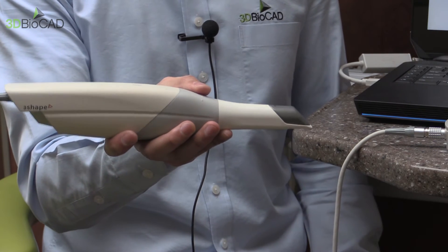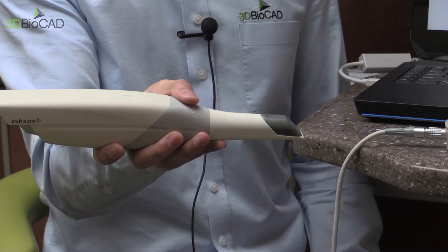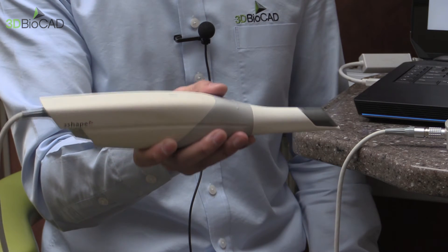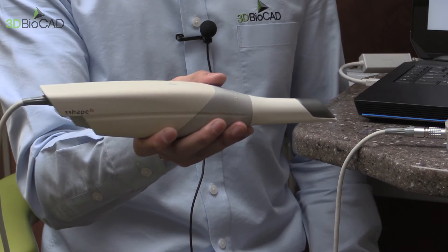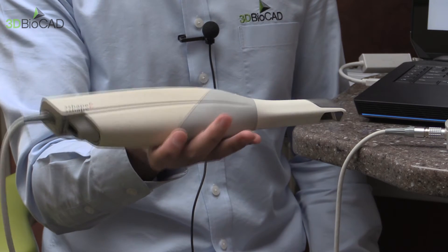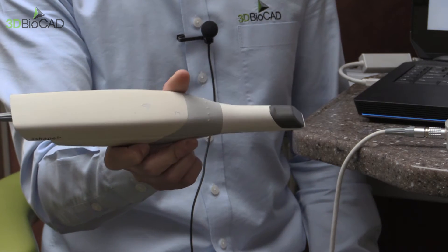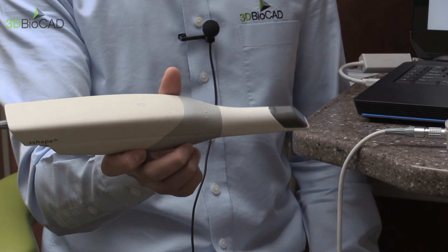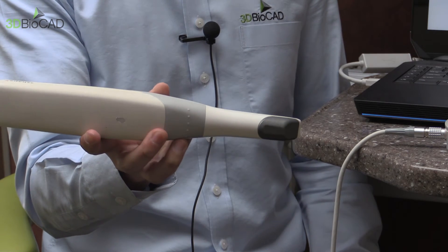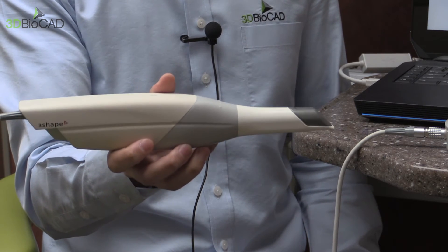The way I grip my scanner, I put my thumb on top of the switch — it's easier to activate the scanner. A lot of times when you're scanning, people try to grab the scanner really tight because they don't want to drop it. But just make yourself comfortable. In order to scan better and quicker, grab the scanner lightly and you should be able to rotate or maneuver your scanner left and right easier.